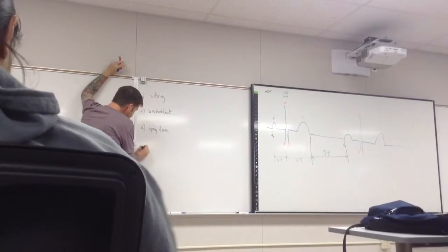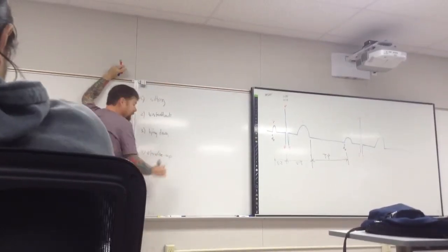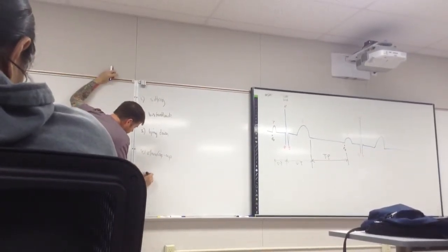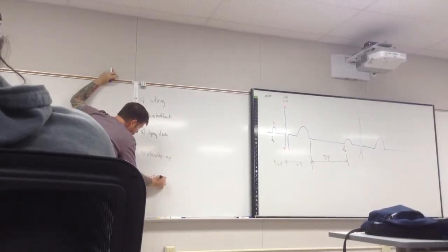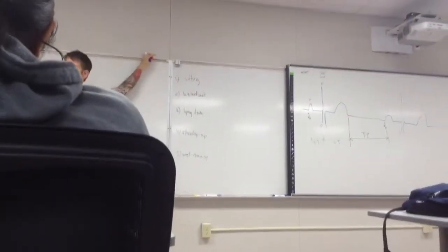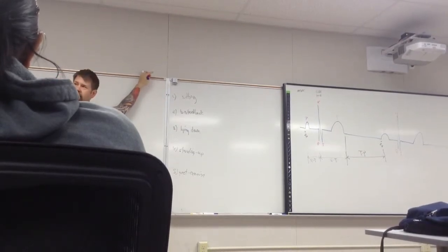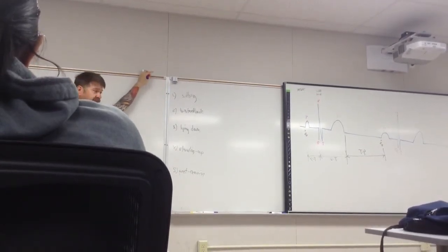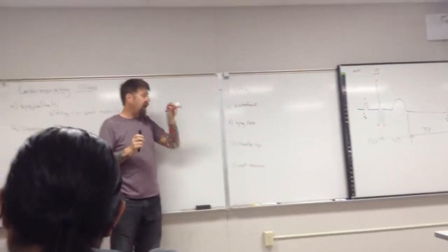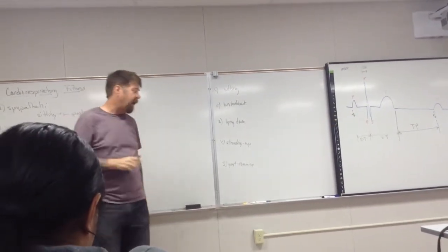And then after that one, you're going to have them stand up. And this is immediately upon standing up, you do this. And then you're going to have them do a post-exercise. The exercise for me here is going to be just a jog around the perimeter of the Science Village. We used to have, when we were in the U building, just go up and down the stairs once, but here just a jog around the Science Village and come back. And as soon as you get back, immediately you need to do the value. Now the way I've got the lab written is not the best order within which to do things, but I had to have it separated out.